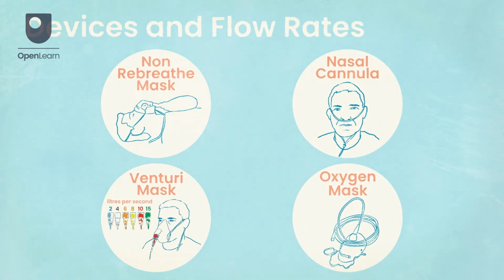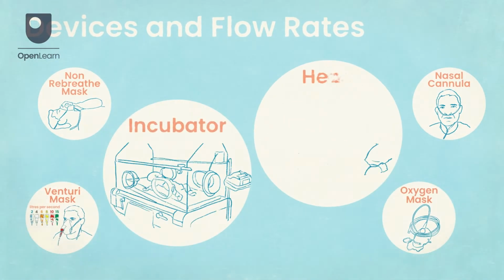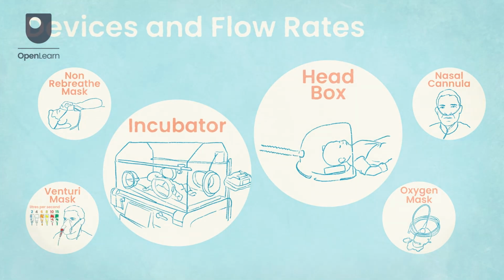Oxygen can be given to children and young people using the systems previously discussed. Neonates and young babies may receive oxygen in incubators or using headbox systems.